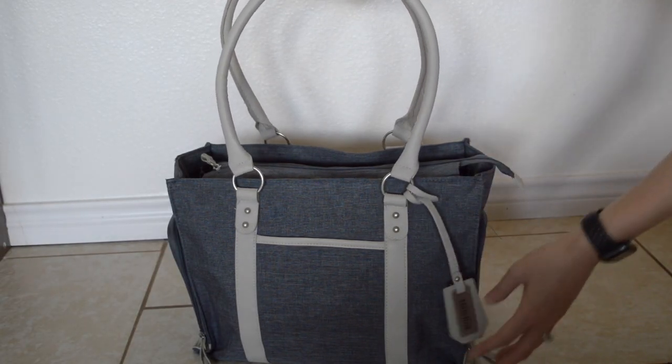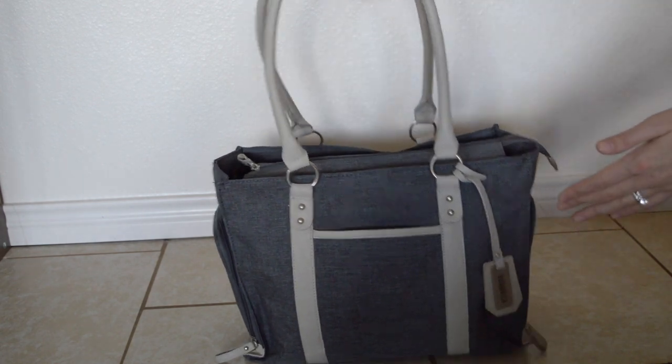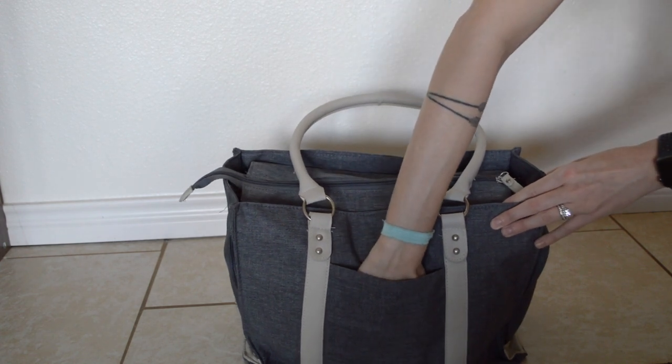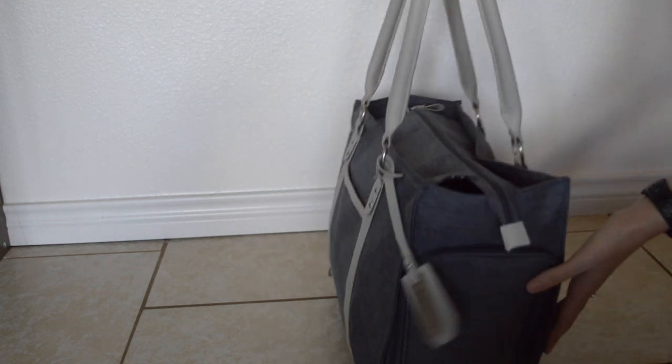Today I'm going to be showing you how I have packed my Banana Fish pump bag. This is the bag — there is a slip-down pocket right here that goes all the way to the bottom. Same on the back: it has another slip-down pocket that goes all the way to the bottom as well. On each side you'll see that there are full zipper pockets, but each pocket is a little bit different.